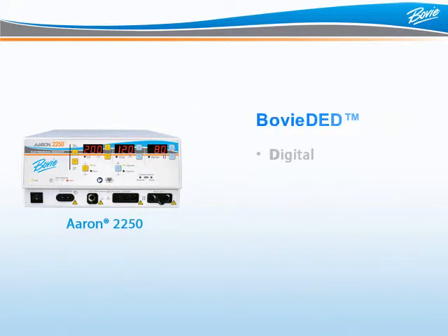BOVI has also developed BOVI-DED, or digital error detection, meaning unsurpassed safety for the patient, surgeon, and staff. BOVI-DED monitors all functions of the unit to ensure the ARIN 2250 delivers proper, top-notch performance. At the sign of any problem, the machine instantly disables the output and an error code is displayed.